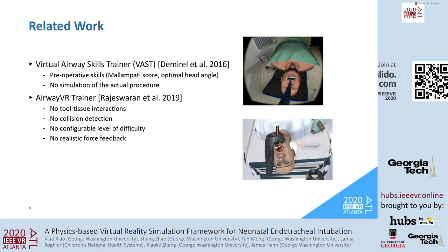In VAST, only 2 tasks prior to the procedure instead of the actual intubation are simulated. In Airway VR, even though it's capable of simulating the entire procedure, however, the virtual model only allows limited interactions, such as head elevation and jaw opening. Both soft tissue deformation and tooth tissue collision detections are not implemented, which are essential for realistic simulation. The instruments are controlled by hand controllers, which is not intuitive and does not offer realistic force feedback.